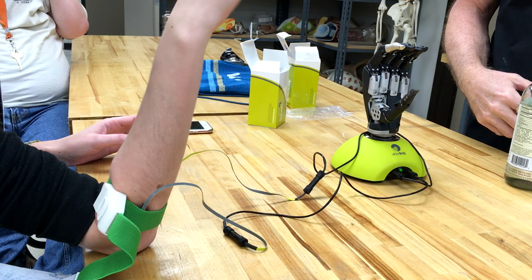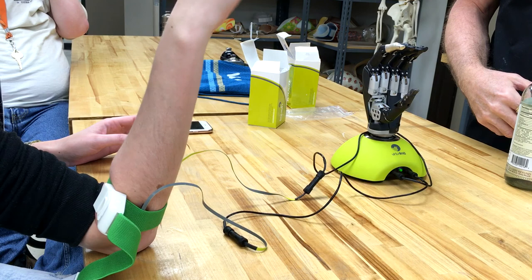Now use wrist motion. Well, you're already open. Now close it. Whoa.